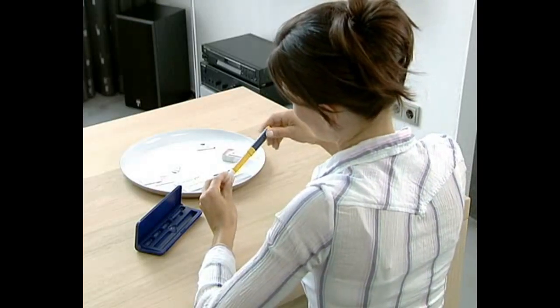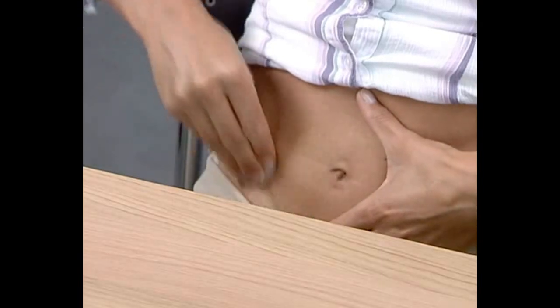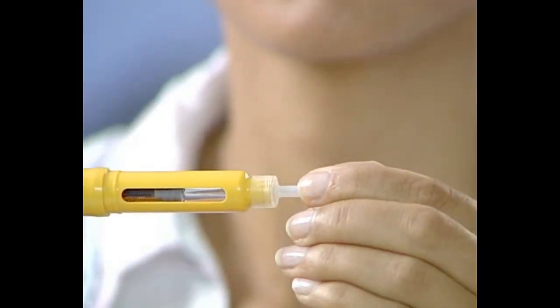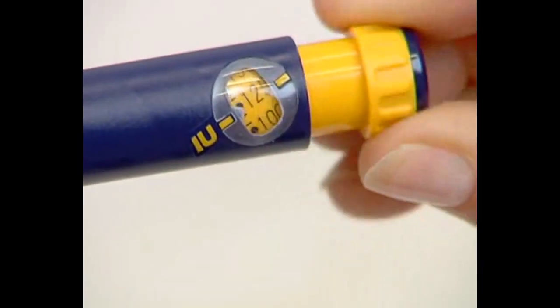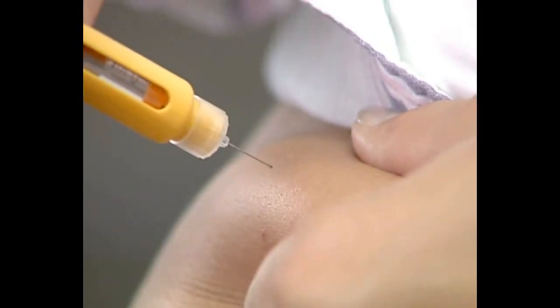Your Purigone pen is already loaded, and all you need to do is attach a new needle and prepare a new area of skin for your injection. Then remove the outer and inner needle shields, as shown in preparing for your injection, and simply look for a droplet forming at the tip of the needle. If a droplet forms, dial the dosage knob until you reach the required dose you need to inject, and inject the required dose of Purigone.